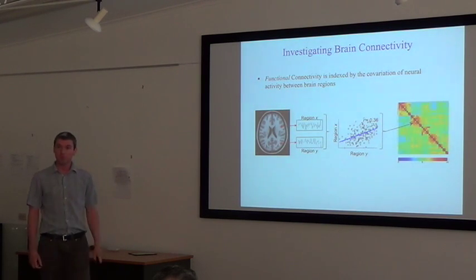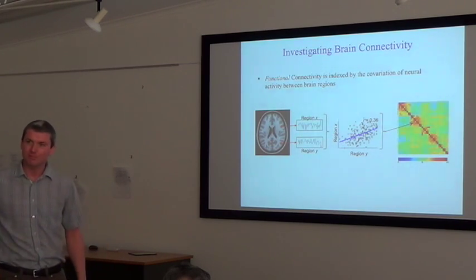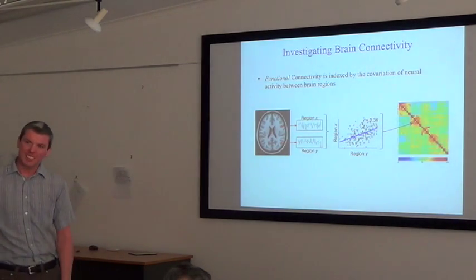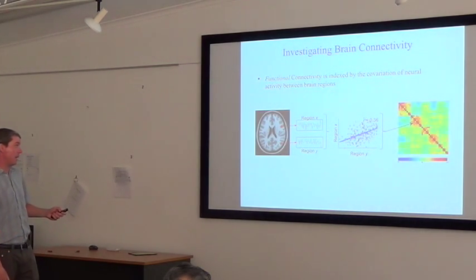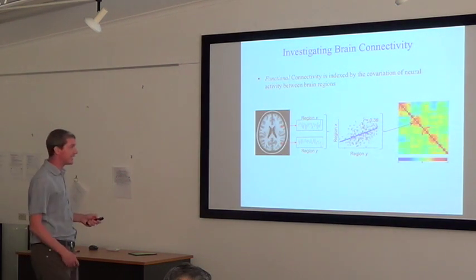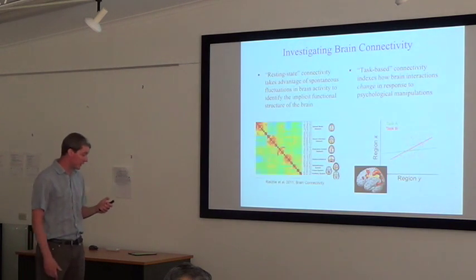Sorry, can I ask a really quick question? Yeah. The high correlations are clustered together. Is that based on a spatial...? Yeah, it's a topological structure. In this case, this is not ordered arbitrarily, sort of A to Z. It's actually ordered by lumping together regions that form networks.